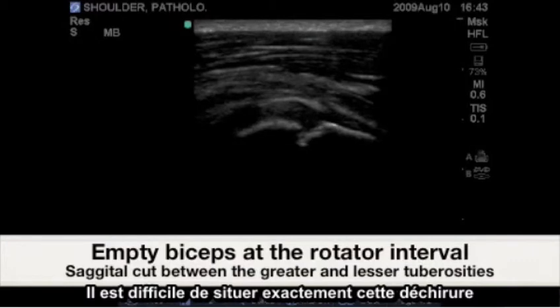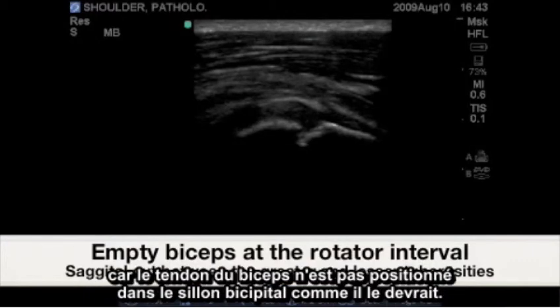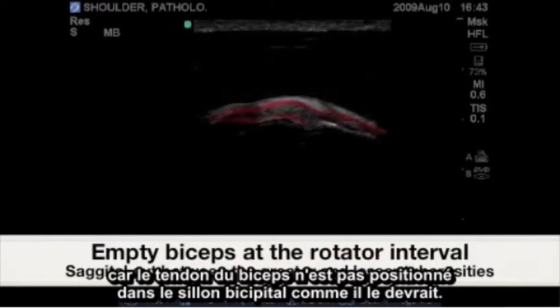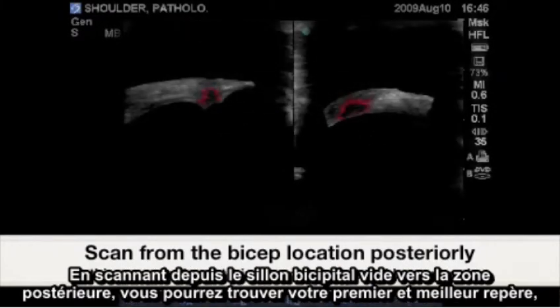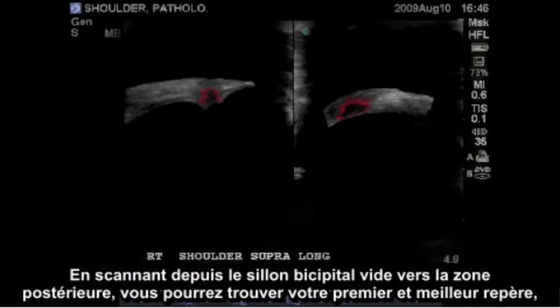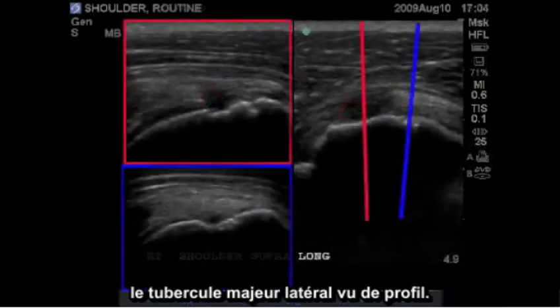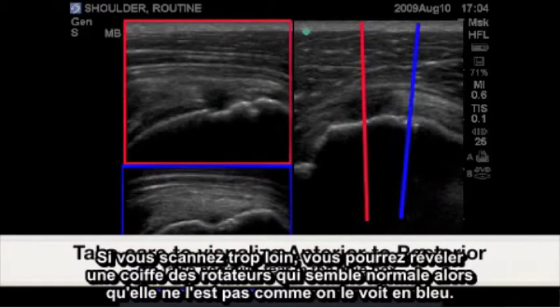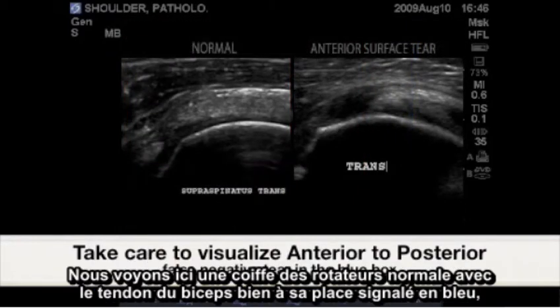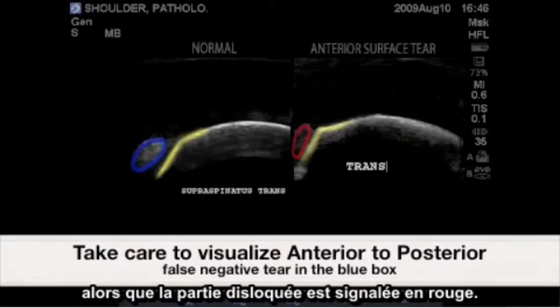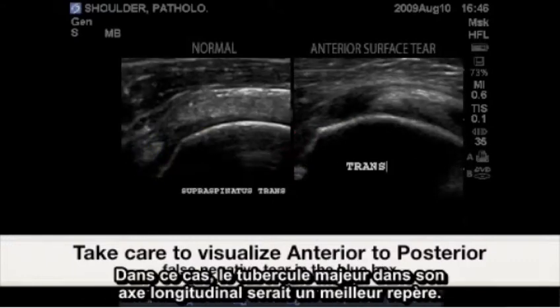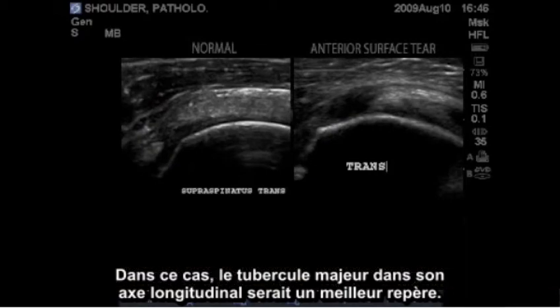Locating the exact site of this tear is difficult as the bicep tendon is not in its normally situated bicipital groove. Scanning from the empty biceps groove posteriorly will reveal our first and best landmark of the lateral greater tuberosity in profile. Scanning too posteriorly may reveal a falsely normal rotator cuff as demonstrated in blue. Here is a corresponding normal rotator cuff with a normally situated bicep tendon highlighted in blue, where the dislocated is in red. In this case a long axis greater tuberosity would be a better landmark.